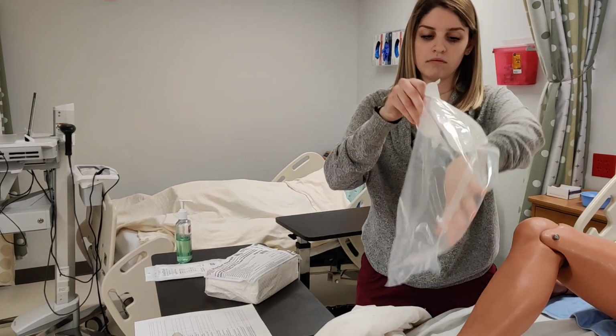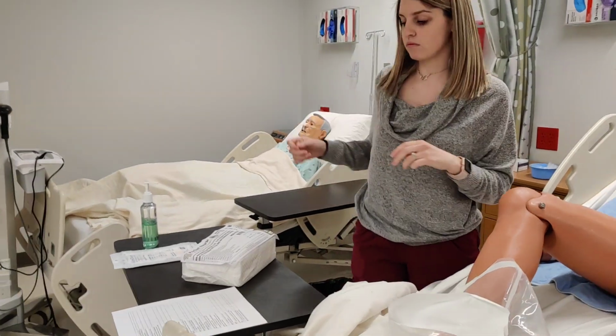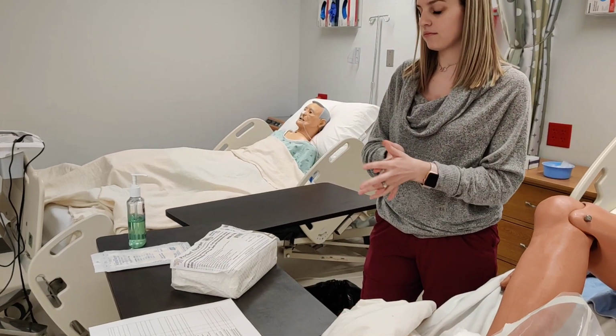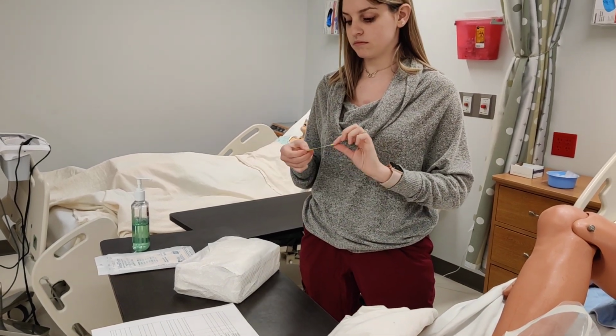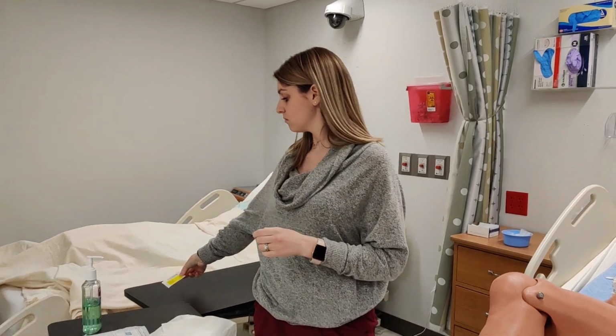So when Gabby opened that package, the whole kit comes out in one rectangular container. The paper that is in the package with it, that is just the label. That can be thrown away. Right, there's also a label itself for the Foley. So we'll set that aside for later.